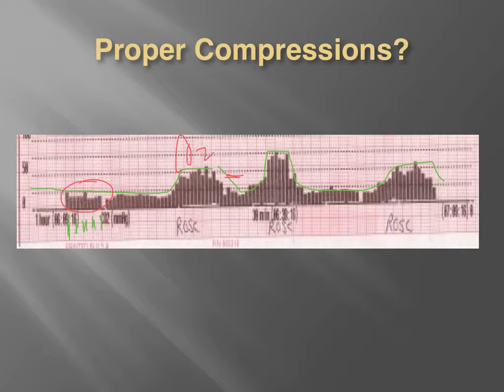Okay, you may have a 15-20 point increase in carbon dioxide, but usually it'll level out because the body returns back to the normal carbon dioxide production and output. When someone's heart stops beating, blood's no longer obviously being circulated, so therefore carbon dioxide isn't being produced and circulated in the same way. So we do get some buildup of carbon dioxide, but it's not nearly as much as if someone had stopped breathing first and then their heart stopped. If someone stops breathing first, we have a huge backload of carbon dioxide buildup in the circulatory system, just waiting to be offloaded by the lungs.